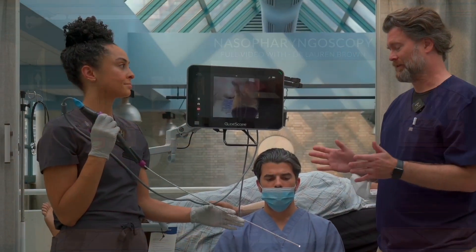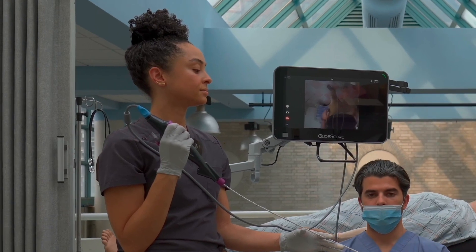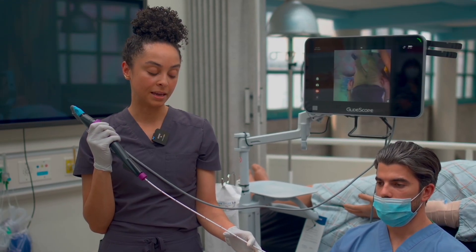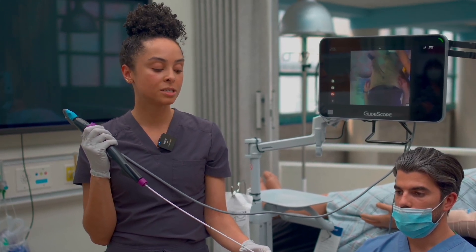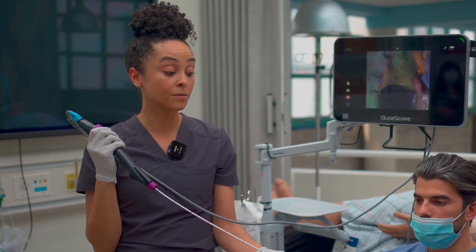All right Lauren, so I think the next step is really just understanding — give us your advice on how you drive this device. All right, so I've already topicalized the patient with some lidocaine, and then while that's sitting we're getting the scope set up. An important part of doing that is just familiarizing yourself with the scope, because there are different scopes and different people have different techniques they feel most comfortable with.